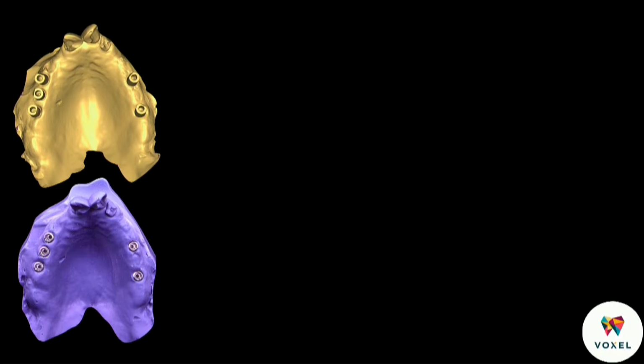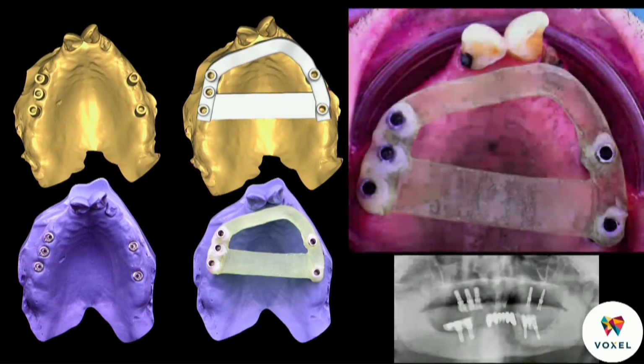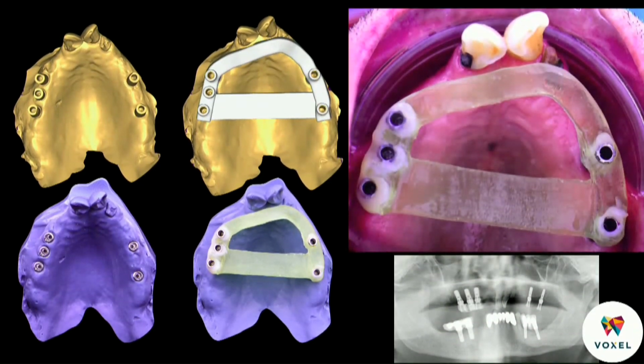Next, I wanted to make sure that the model was accurate before making the commitment of extracting the remaining teeth. So with the help of my colleagues, Dr. Asil Tamimi and Dr. Basil from Voxel, we designed and printed a verification jig just to verify that our model was accurate. And this was probably one of my best days when I saw the verification jig well seated in the patient's mouth.